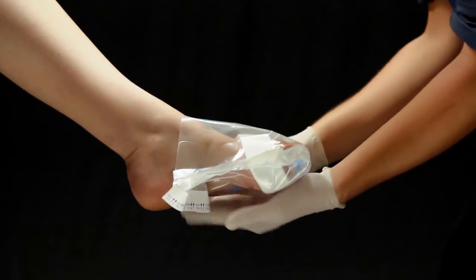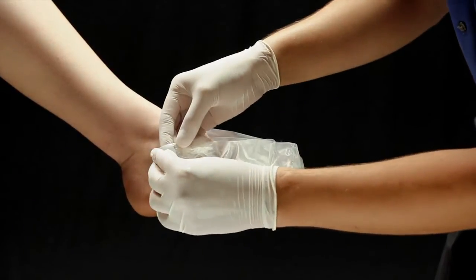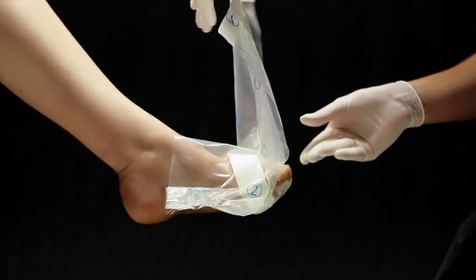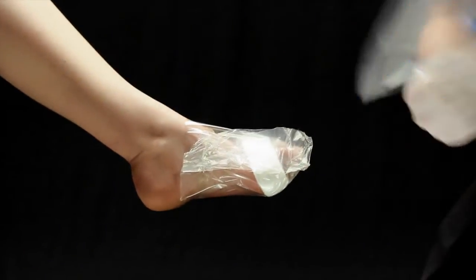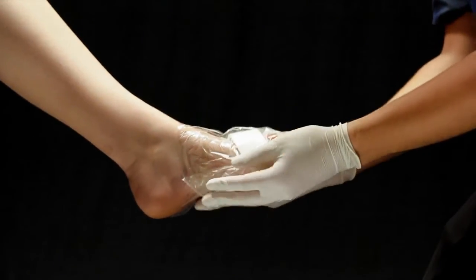After the foot is completely encased in the film, pat down around the edges to ensure a good seal. Carefully remove the second layer of the film backing once it is on the foot. Recheck to make sure all of the film is sealed securely around the foot. No trimming is necessary.